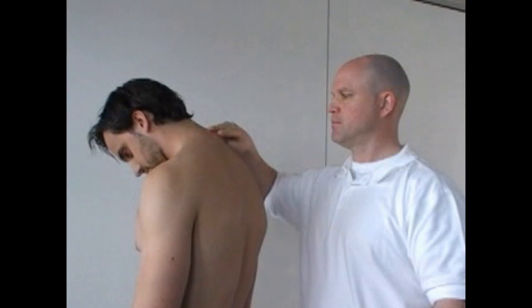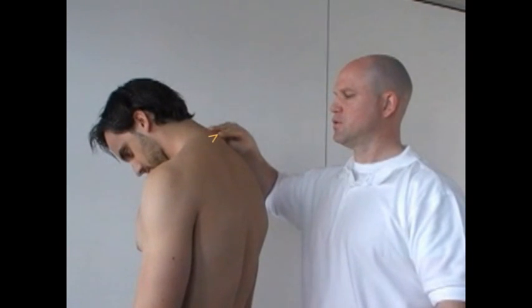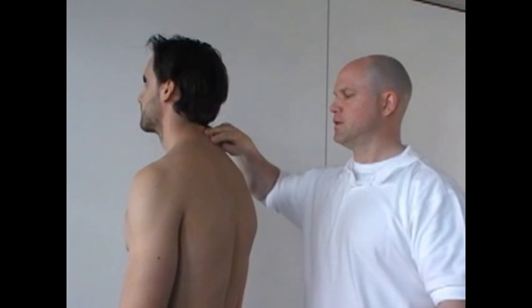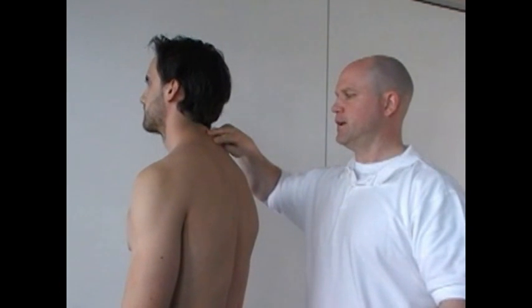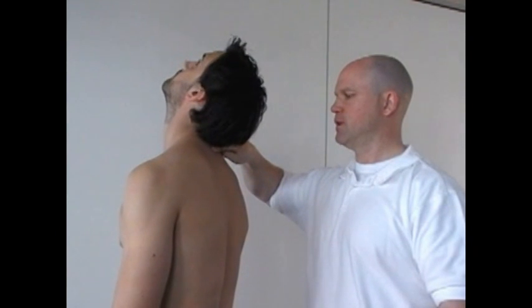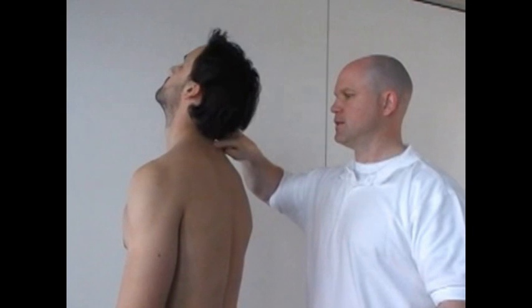The examiner keeps his right forefinger on the 7th cervical vertebra at the so-called C7 and his ring finger on C6. To make sure that the position of C7 is correctly palpated, the examiner should ask the participant to extend the head. If C7 is correctly determined, then C7 won't, but C6 will disappear during maximal extension of the head.